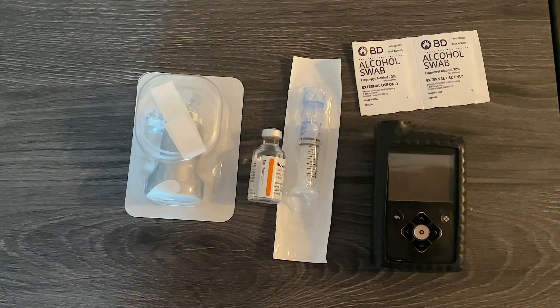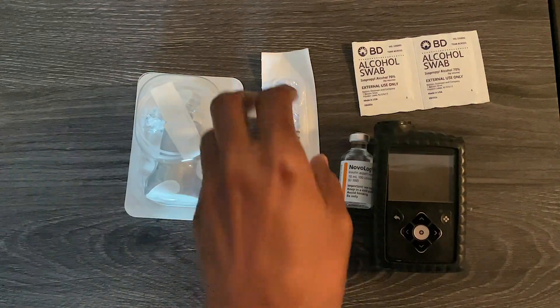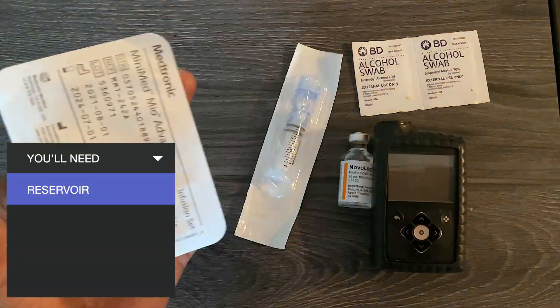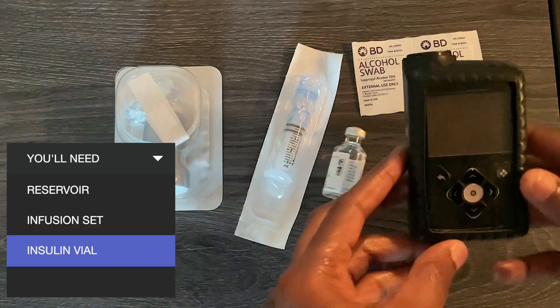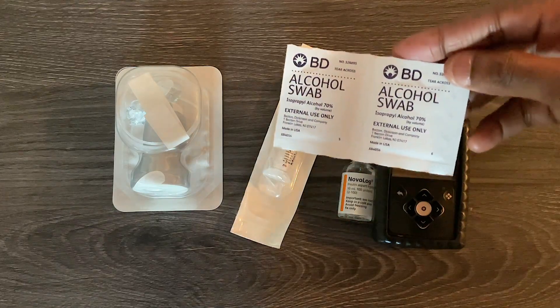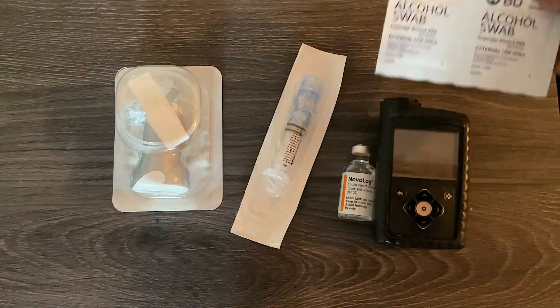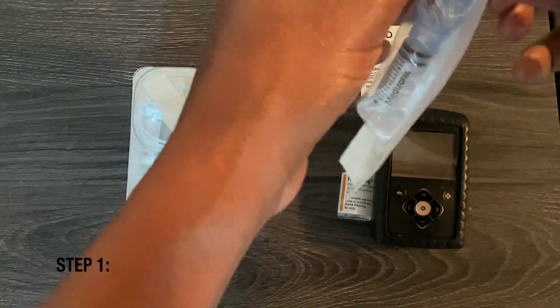This video is going to show you how to fill your insulin pump with insulin. You're going to need the reservoir, the infusion set, your vial of insulin, your pump, and some alcohol swabs to clean the area where you're going to apply the infusion set.